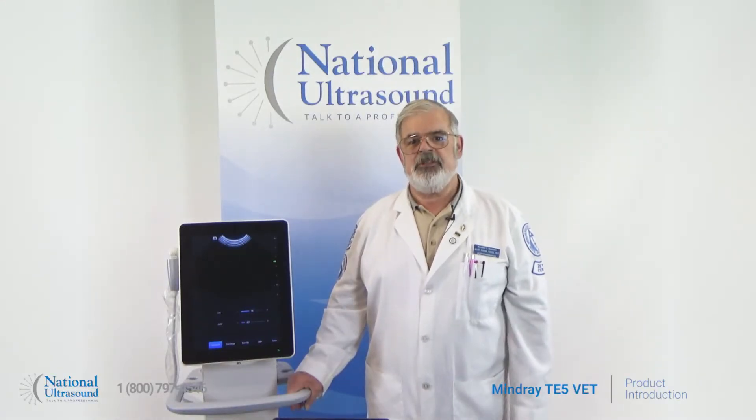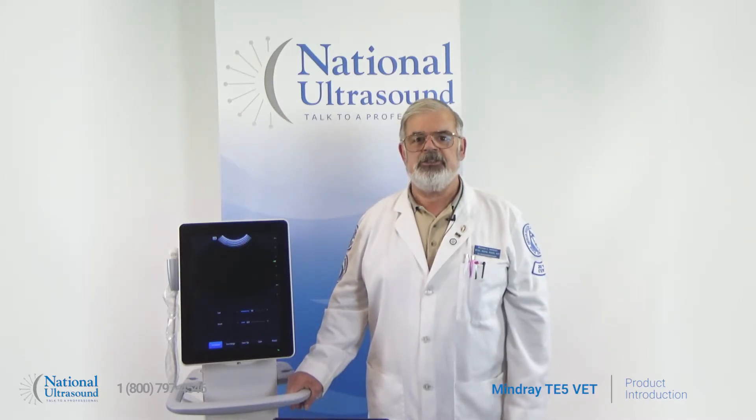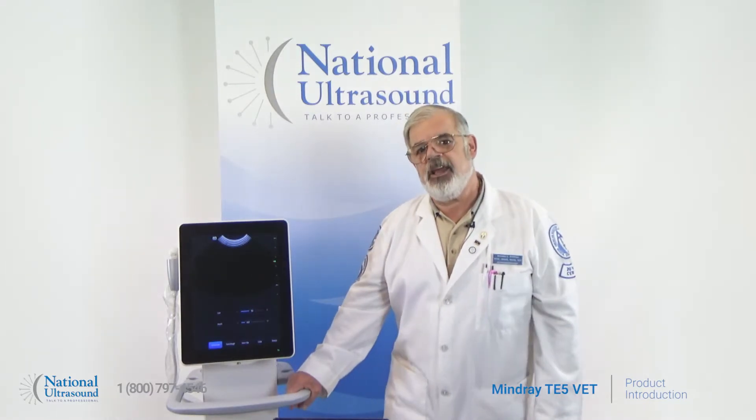Hello, my name is Richard Simpson. I've been a registered ultrasonographer for over 39 years. I first started working as a veterinary sonographer in 1991 with Dr. Cartee at Auburn University. Today I am reviewing the Mindray TE5.